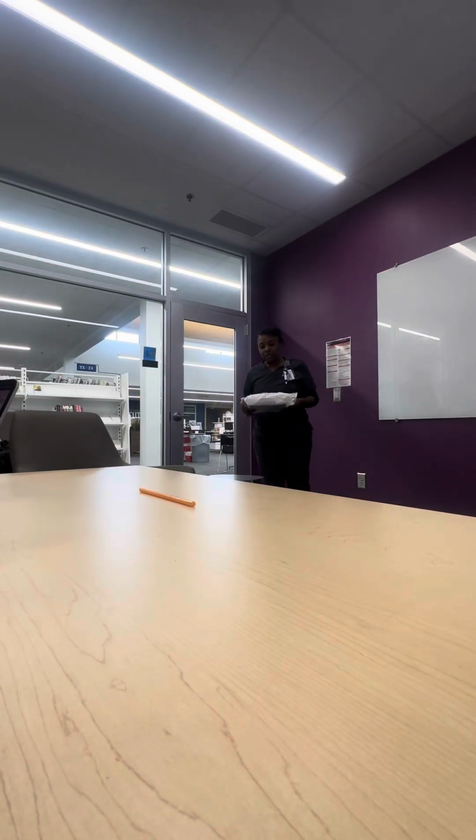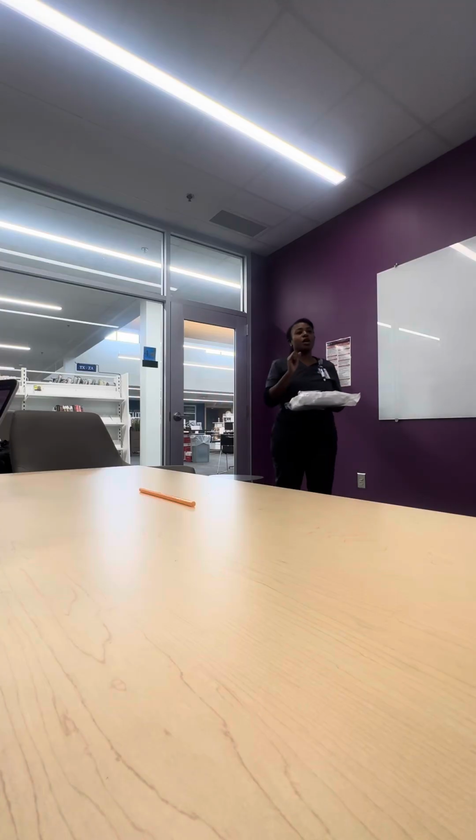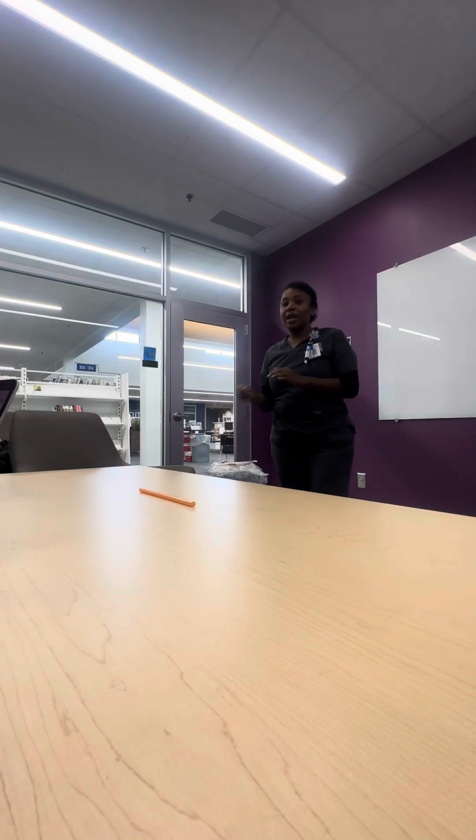Alright. I have checked the provider's order. I have checked the facility procedures. I have gathered all my supplies. I'm gonna knock on the door, my patient's door. I'm gonna perform hand hygiene.